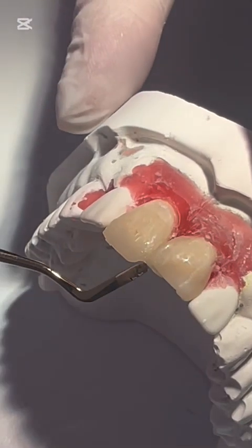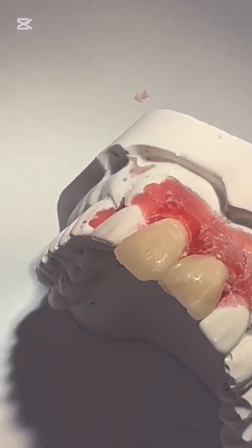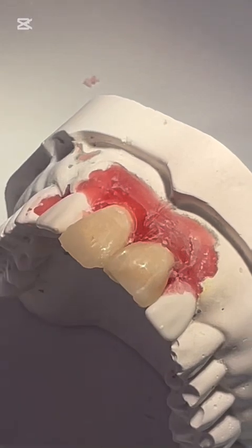I will continue with the second tooth, but we don't have silicone here, so I cannot take an impression, right?